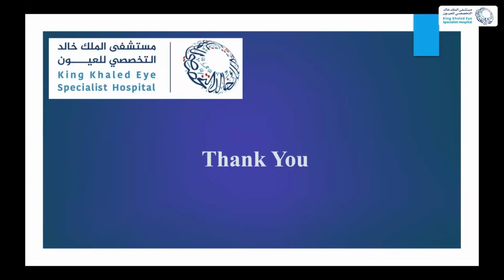So that's why I bring in this presentation that only OCT. Because I know OCT is present in all centers, but of course OCT angiography is very helpful in these cases. Okay, there is another comment I have here, because this is a topic I really love.